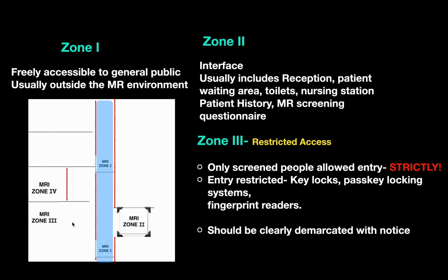So only screened people are allowed. It is restricted with a key lock system, a pass key locking system, or a fingerprint reader. It should be clearly demarcated with a notice.